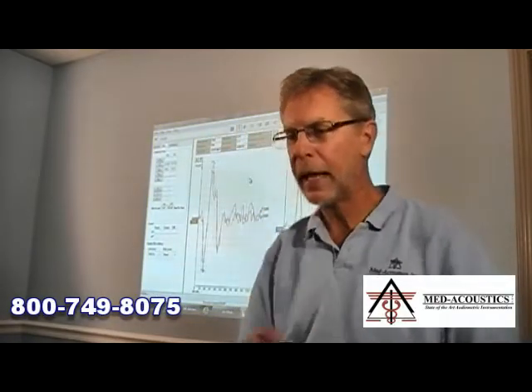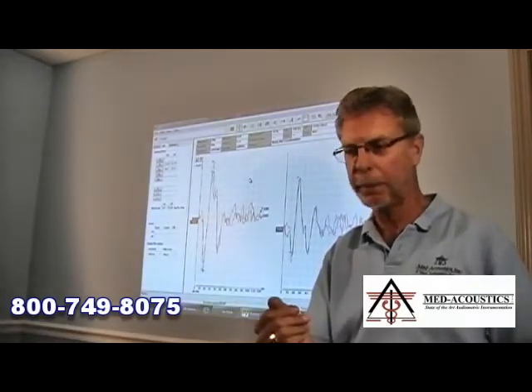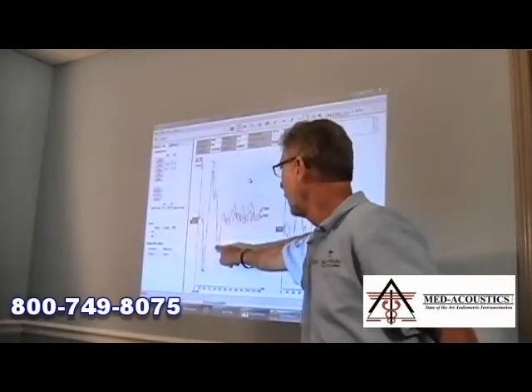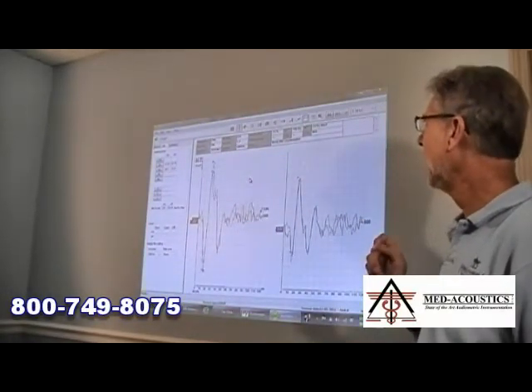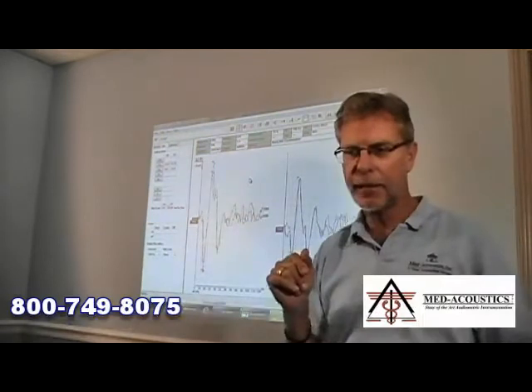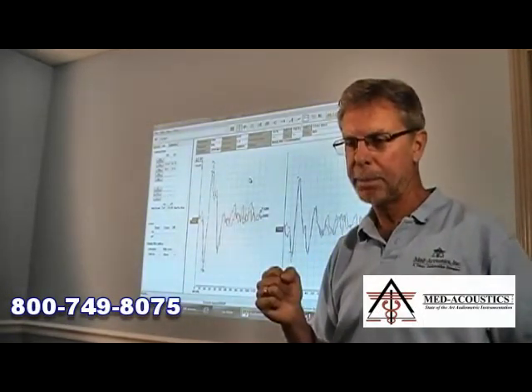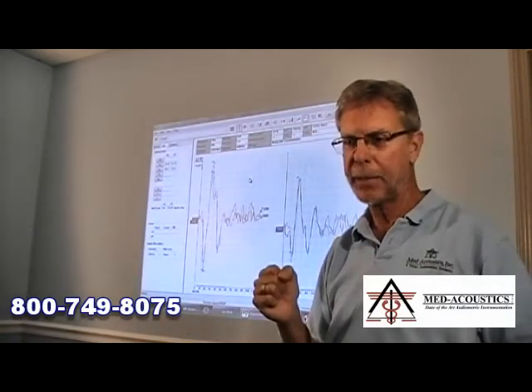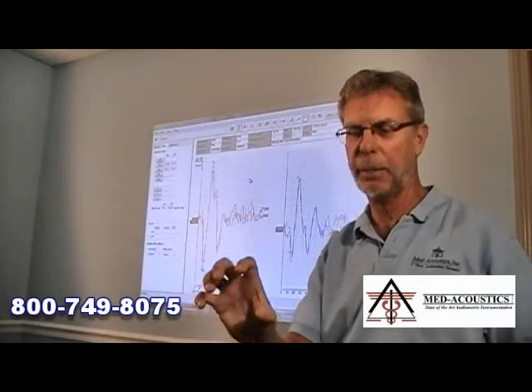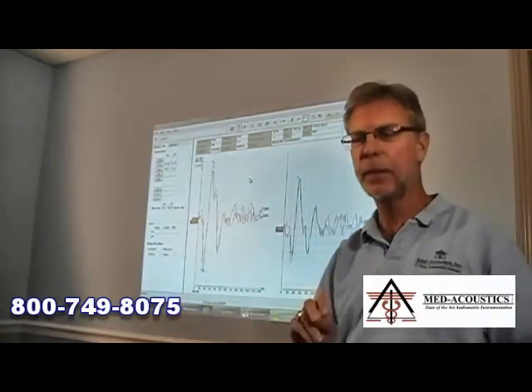There it is. And you see how nice of a response that we have here. This is the VEMP response on the right. Here's the VEMP response on the left on this patient, Jan. And in fact, Gary Jacobson and the audiology clinic at Vanderbilt has been working with Interacoustics on this system and on its application of VEMPs.